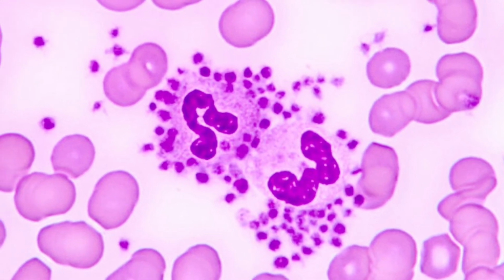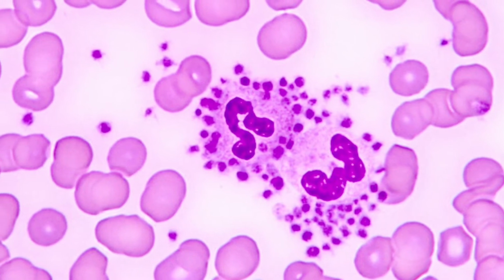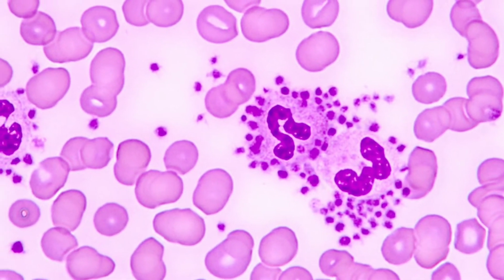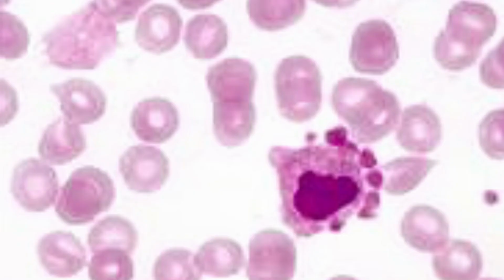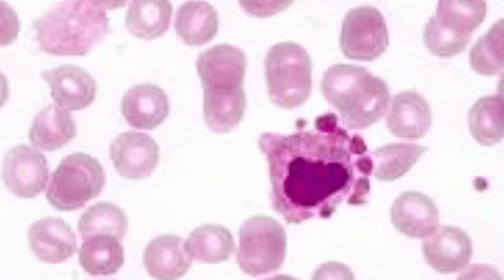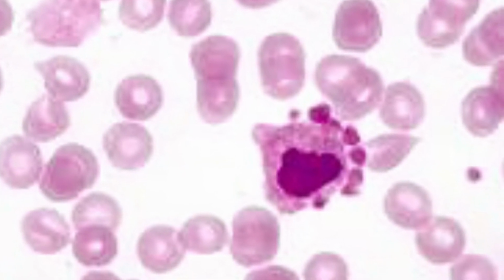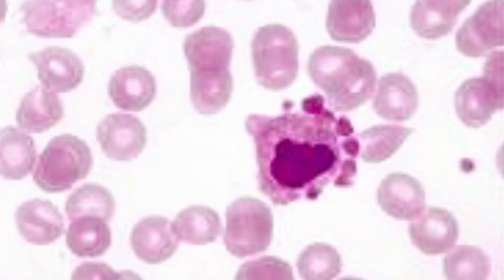PTCP is caused by platelet satellitism, though uncommon, and in other cases, platelet clumping. Platelet satellitism is defined as a rosetting of platelets around neutrophils, as seen here. In rare cases, this rosetting of platelets is seen around other cells, such as monocytes, eosinophils, and basophils. Platelet satellitism is seen mainly in blood smears obtained from EDTA blood.